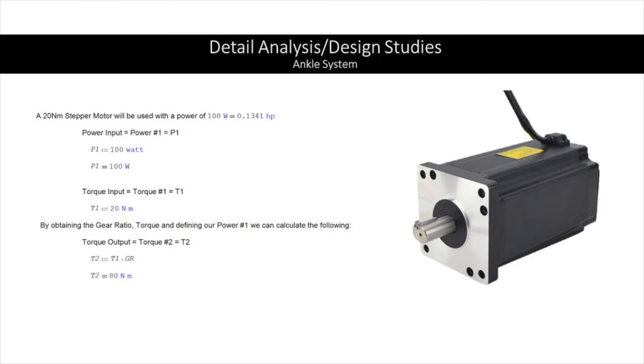Continuing with our ankle system, we chose a 20 Newton-meter stepper motor that will use a power of 100 watts or 0.1341 horsepower.